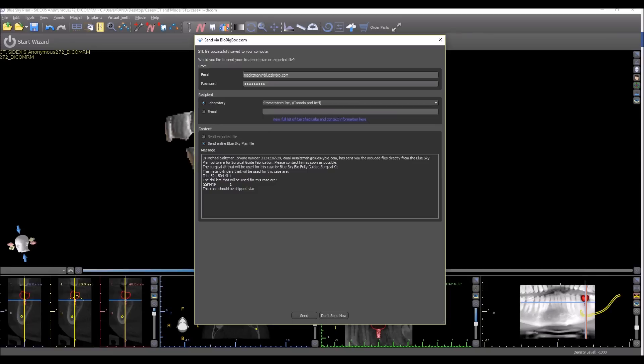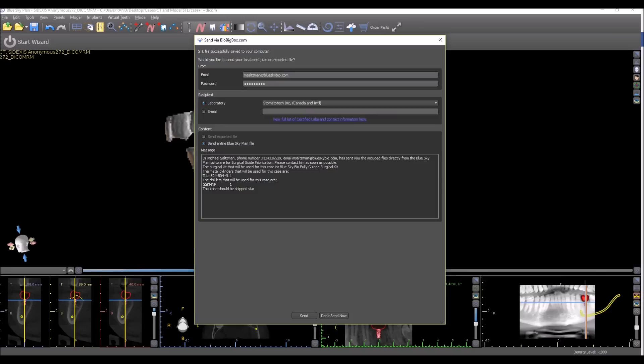Your email address, your login details for BioBigBox appear on the top of the screen, and it will send via your login details for BioBigBox. For those of you who are still not familiar, check out BioBigBox.com. It's a mostly free HIPAA compliant data transfer and storage system.